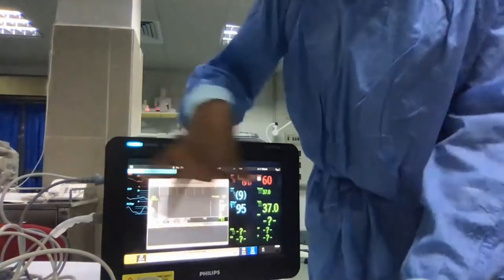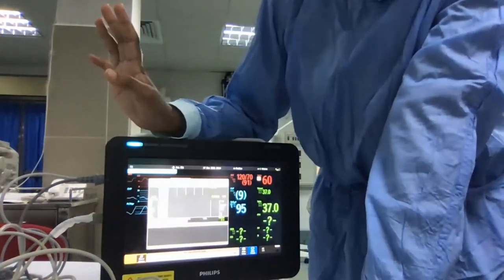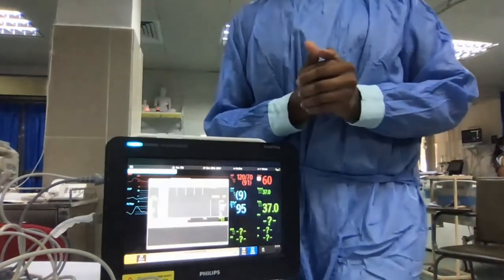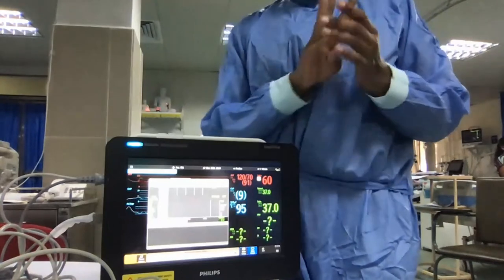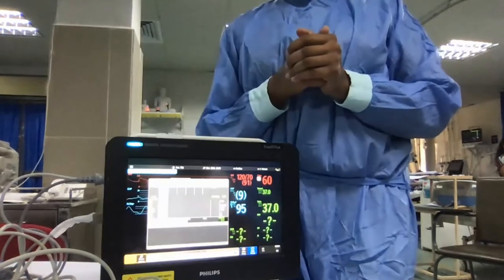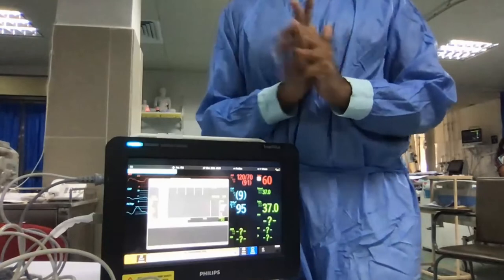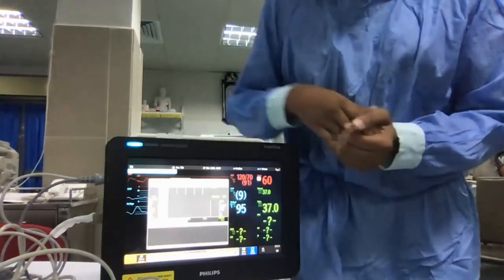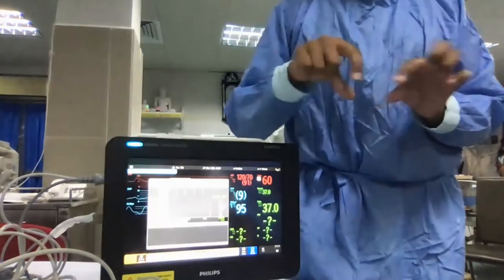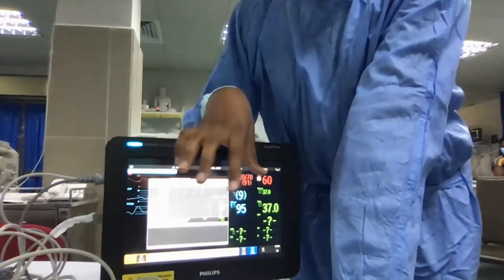Then the window is okay. Now we are ready to do an injection. First of all, you have to prepare. In that video they have recommended to take 3 salines, but normally, madam, through 3 salines I don't think you can calculate an average. What we recommend is around 5 salines. If 3 is okay, no problem. Then we have to prepare that 10 milliliter syringe. The saline temperature should be 0 Celsius, cold liquid.